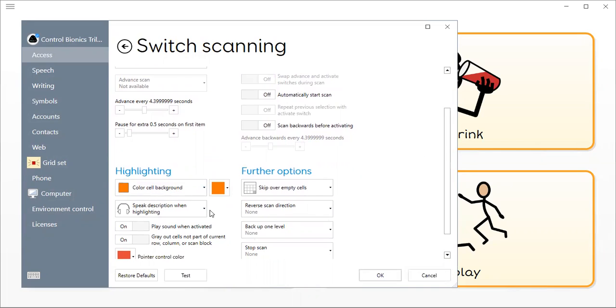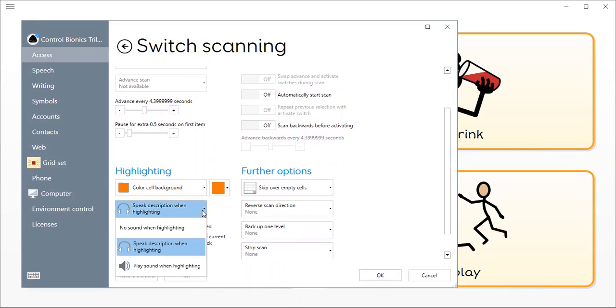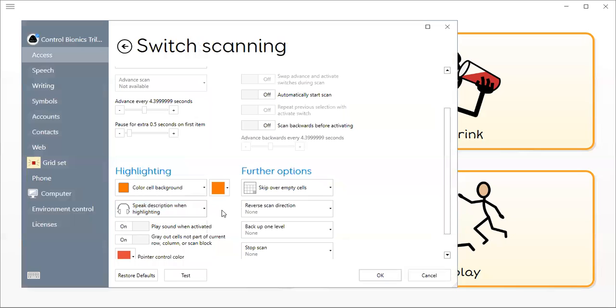I can also choose whether I want it to speak the description or be silent.